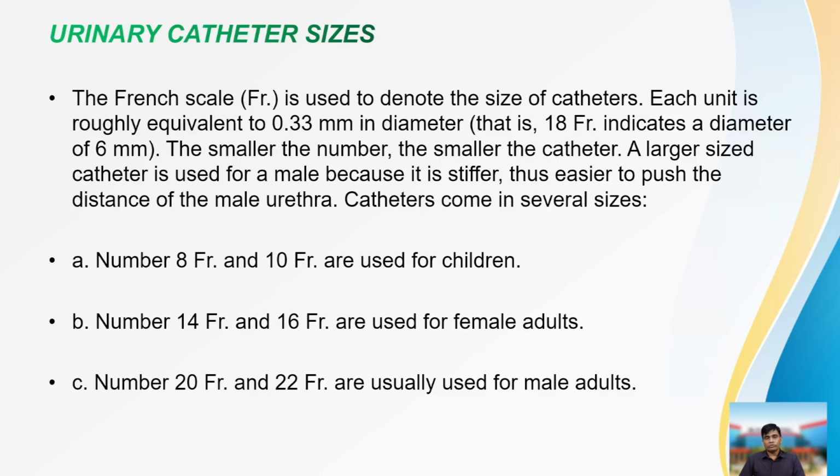Next, we have to discuss the urinary catheter sizes. The catheter size depends on the patient. We check the catheter size on the French scale.